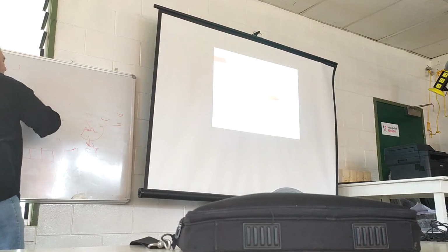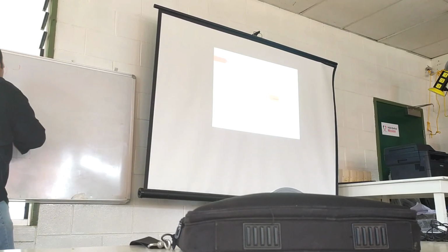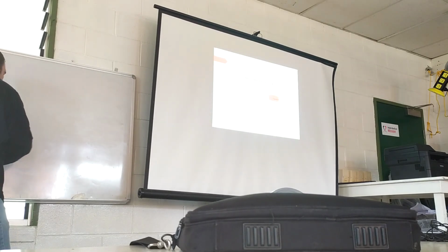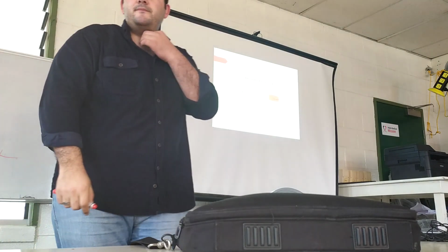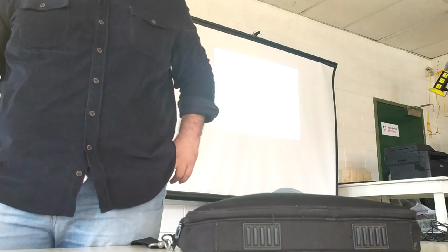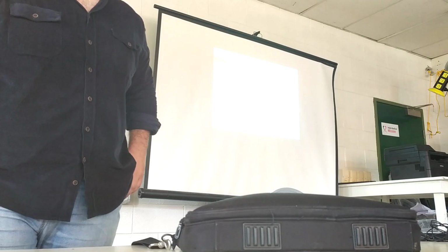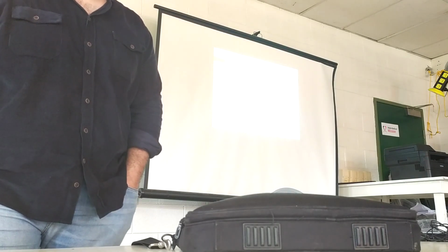If you have a pregnant woman, will you send her to do a CT scan or not? Depends. The rule is mother before fetus. If she had an accident and she came to you, you will send her to do a CT scan, or she's pregnant.